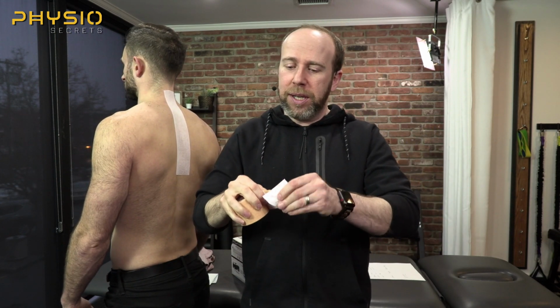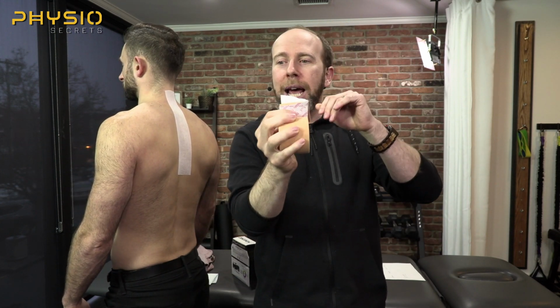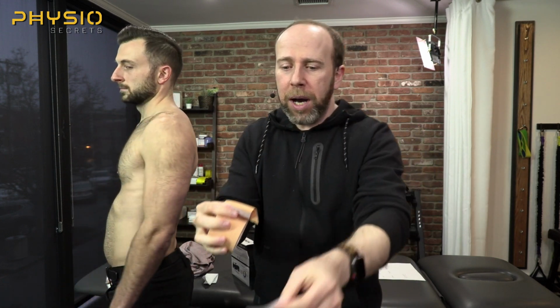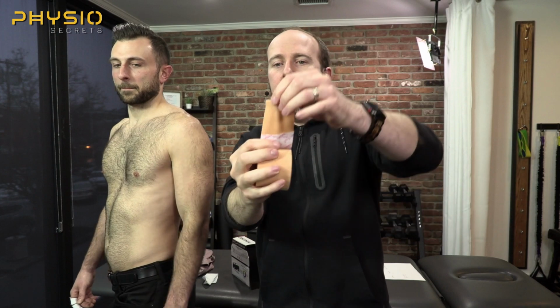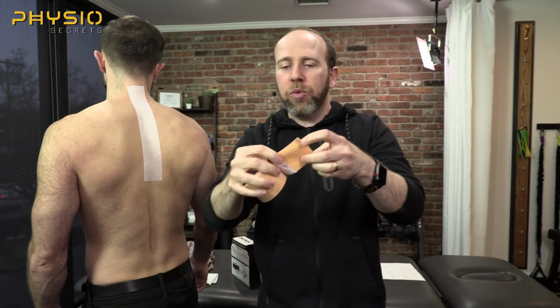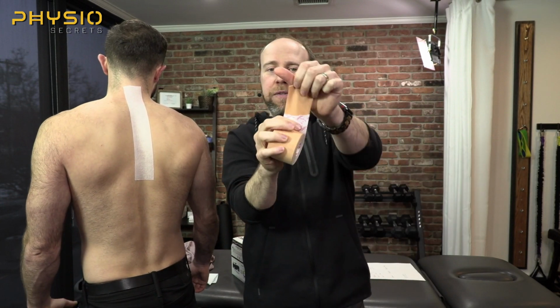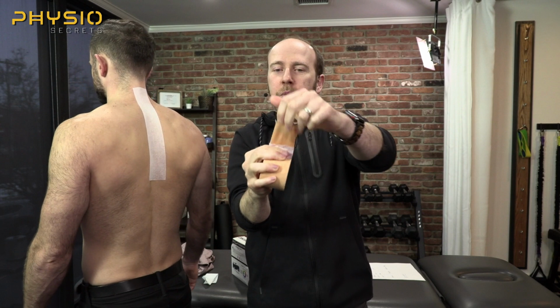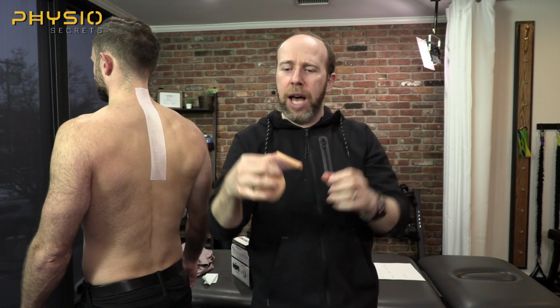Let me tear a piece of dynamic tape. Notice it tears like the Kinesiotape, but you'll notice that it's a lot thicker. It's less porous, so you can't really see through it. It has 3-dimensional stretch, and it's a lot stiffer. Watch when I try to stretch this tape out. That's as far as I can stretch it, whereas with K-tape, you can stretch it out a lot farther.